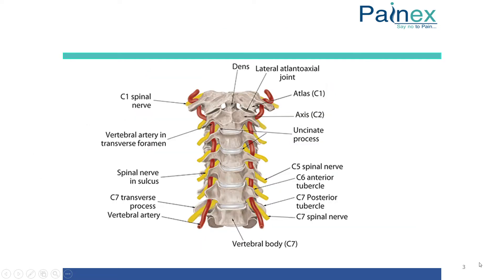These are the cervical vertebrae — C7 and C6. If we have to perform a stellate ganglion block, we can inject the drug at C6 or C7. C6 is preferred. Why? Because you can see the vertebral artery is not exposed at C6 level — it enters into the foramen.